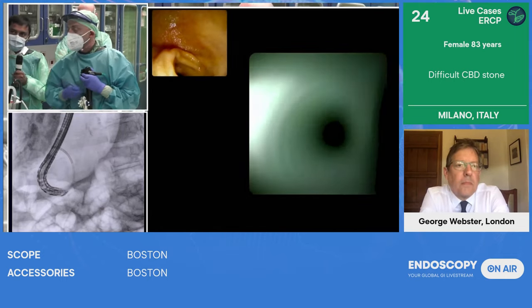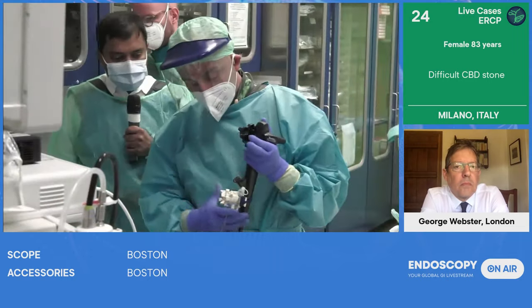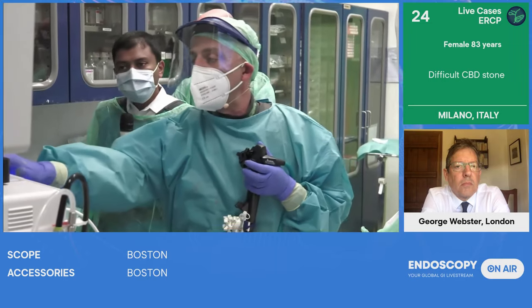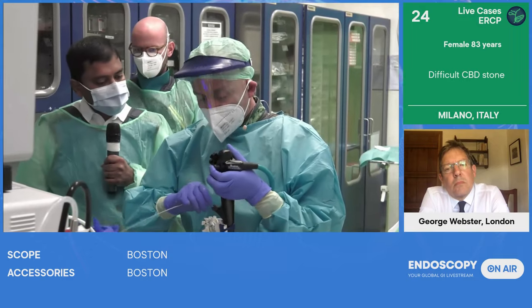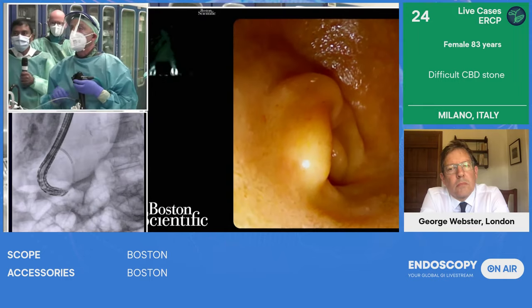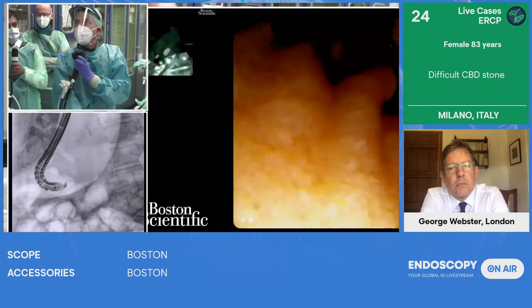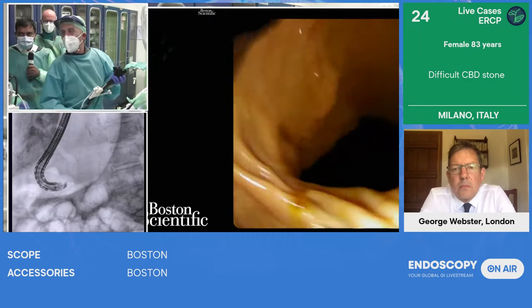So I think we have a fragment of a stone, and yes, we are moving with the next basket, I would think. Yes. Okay. Balloon. We are going to use a balloon just now because I think we did a great job. And with the balloon, I will also be able to inject dye and have a nice anatomical evaluation of the situation. So I may have lost my position just now, but I can go back and forward with my duodenoscope.